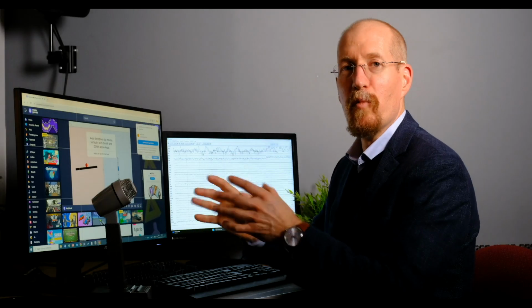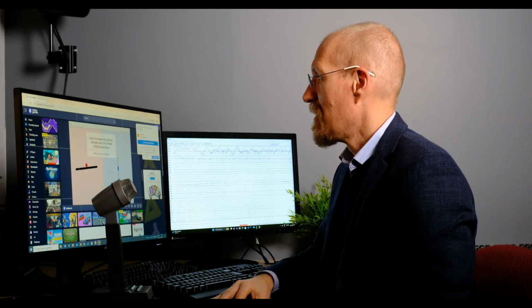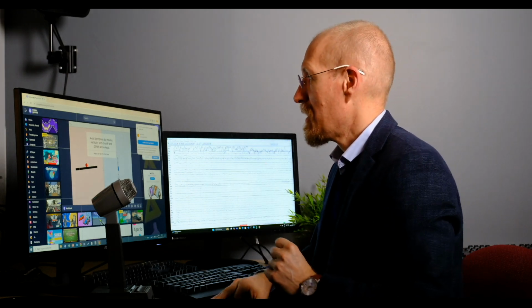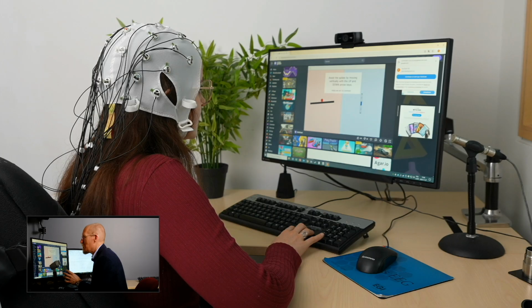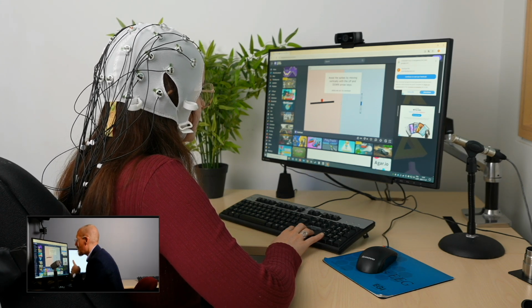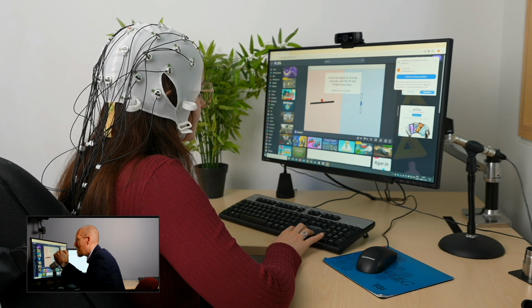Okay, so now we've moved into the simultaneous multitasking state. Once Anne starts this part, I'm going to add my marker. So Anne, now you have to use left and right for the ball. And on the right side, you will see some arrows. They will come from the left side and the right side.